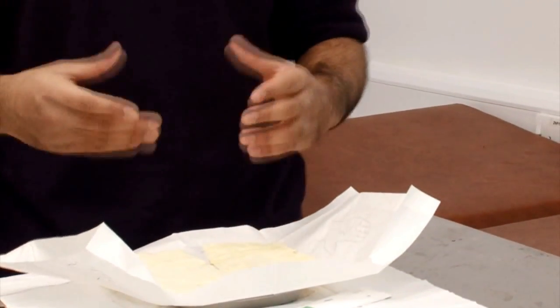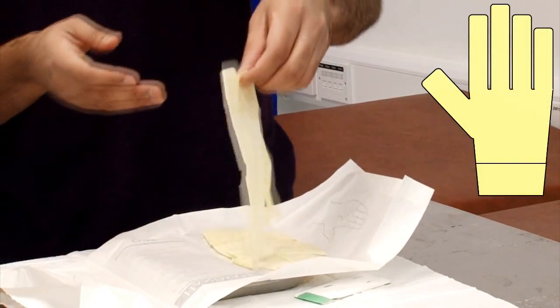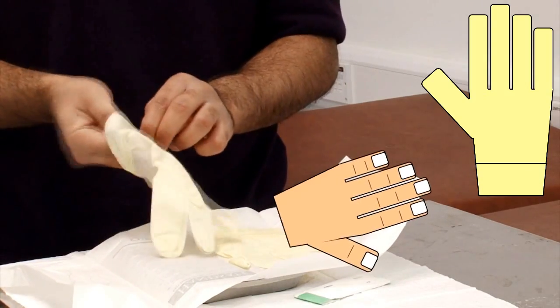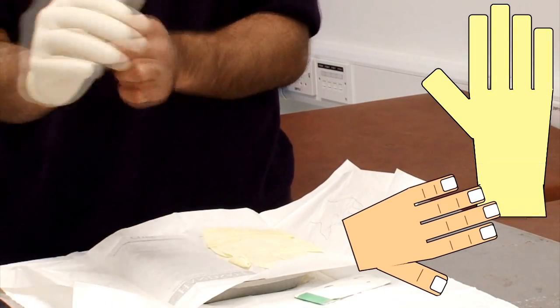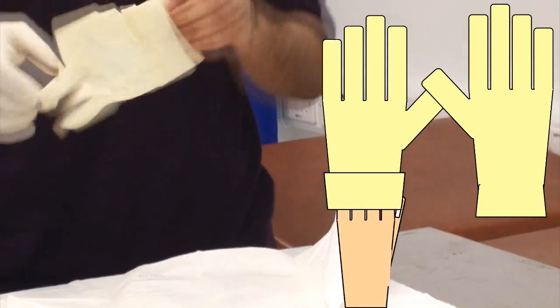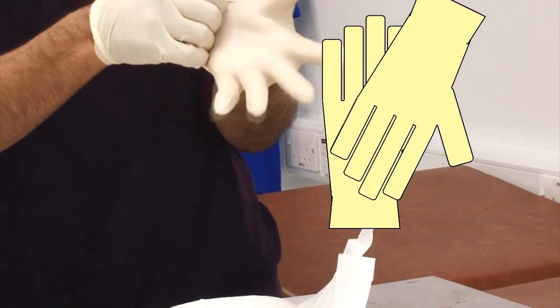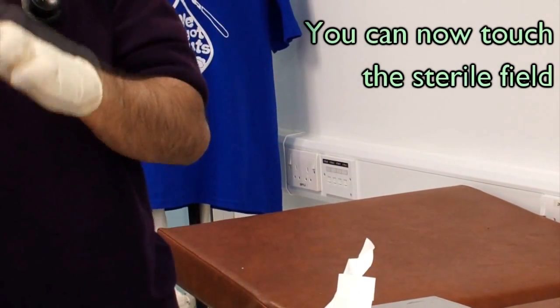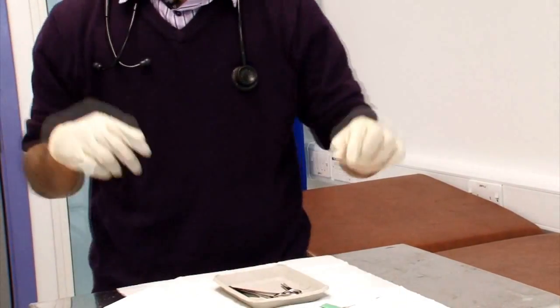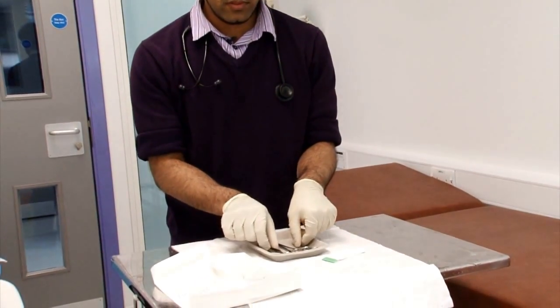I'll show you how to put the sterile gloves on. Remember, the lower areas of the gloves are sterile whereas the top cuff is not sterile. Put the gloves on as such — this is the reason it helps to have the right size gloves. Make sure it's on nicely, put it to the side, and arrange the equipment the way you want it.